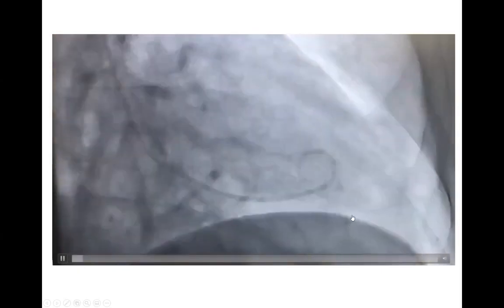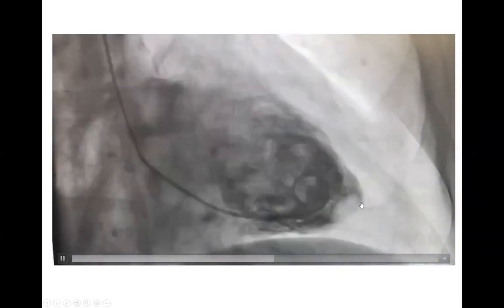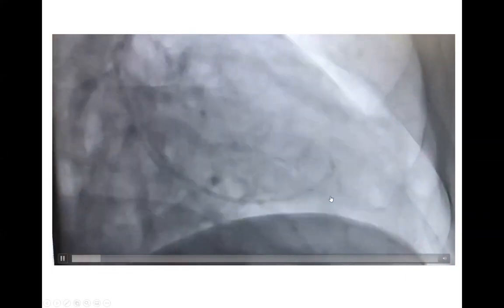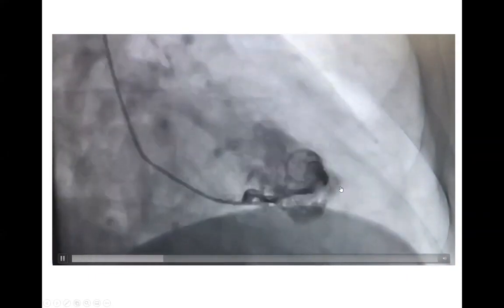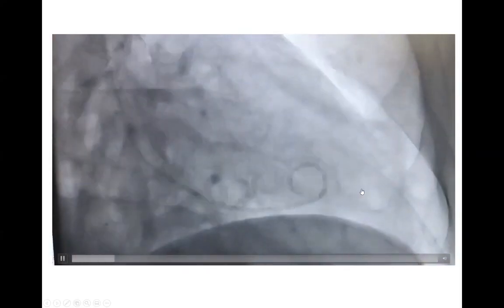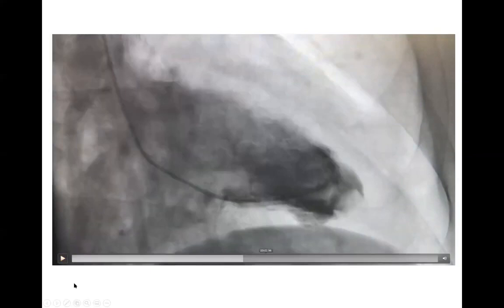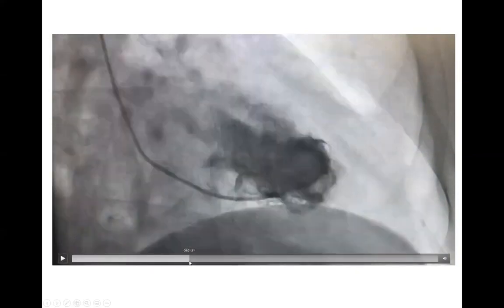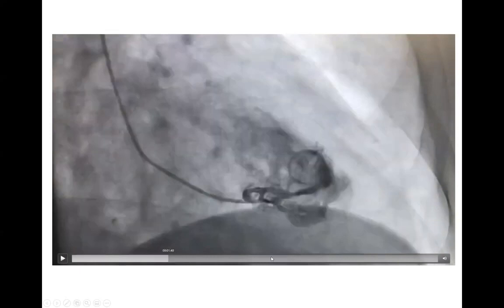There is something else here. I was thinking, isn't it like an aneurysm — or is it a clot? A thrombus. There is a thrombus. I wouldn't call it an aneurysm — just to tell you the difference between dyskinesis and aneurysm.